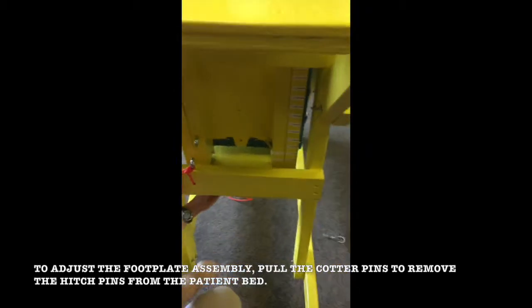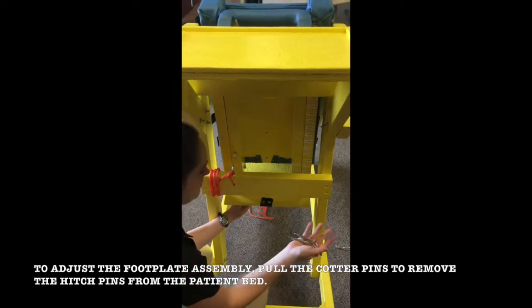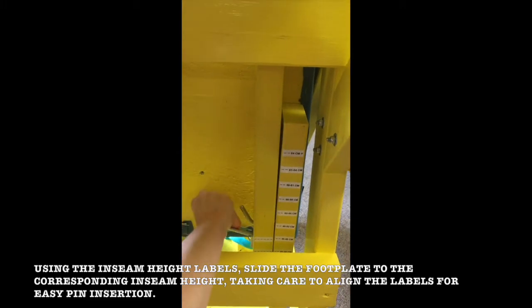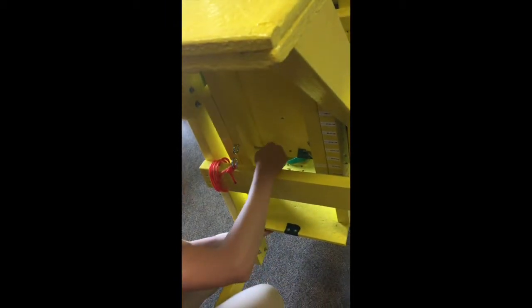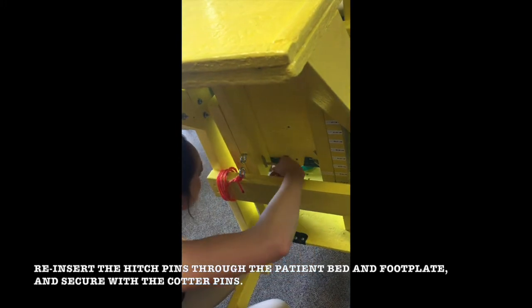To adjust the footplate assembly, pull the cotter pins to remove the hitch pins from the patient bed. Using the inseam height labels, slide the footplate to the corresponding inseam height, taking care to align the labels for easy pin insertion. Reinsert the hitch pins through the patient bed and footplate and secure with the cotter pins.